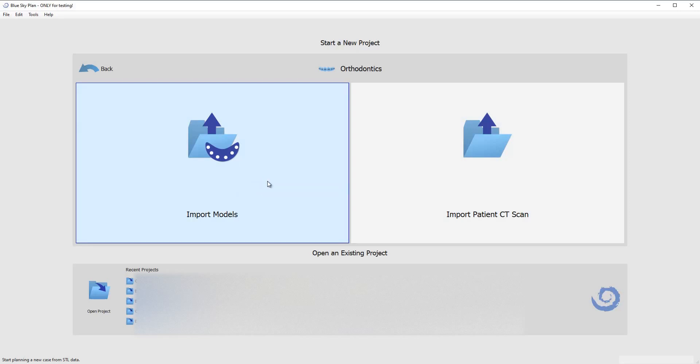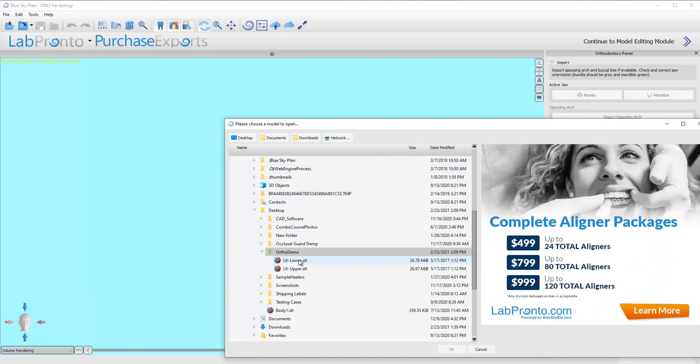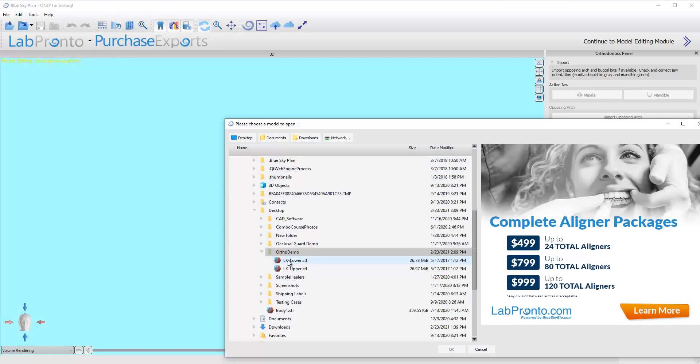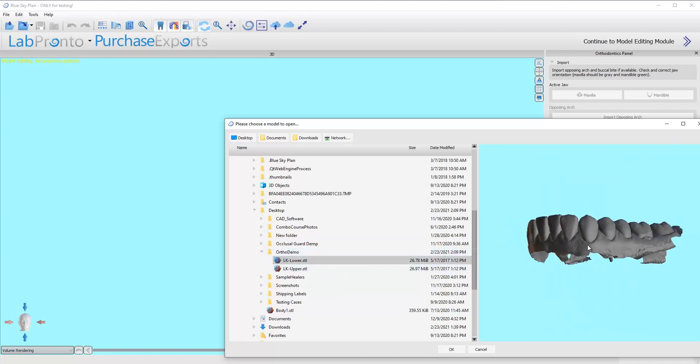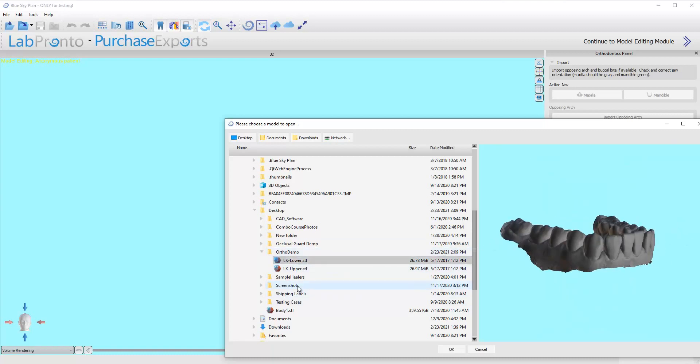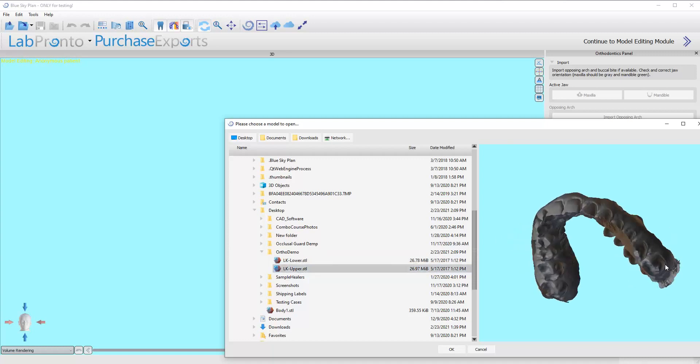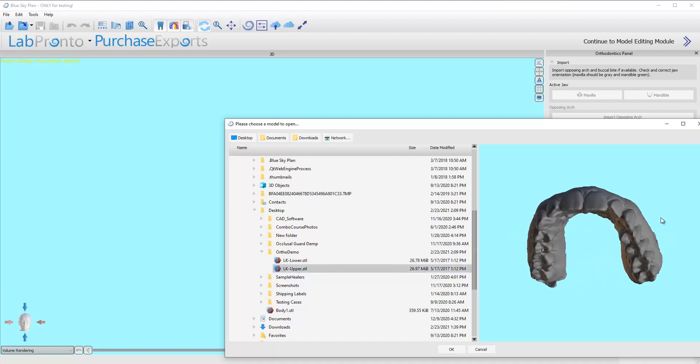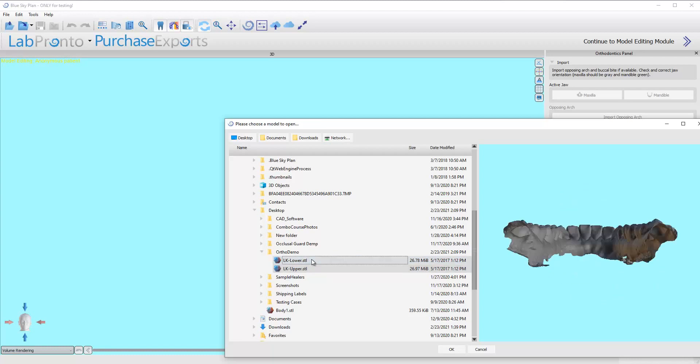It's going to bring up a file browser where we can find those models we want to work with. Now this case might look familiar if you've watched my videos before. It's the same case I've used in the past. So right here I can actually preview the models to make sure it's the case that I'm planning to work on. Here's the upper. So I'm going to go ahead and just hold the control button to click on both of them and I'm going to click on OK.